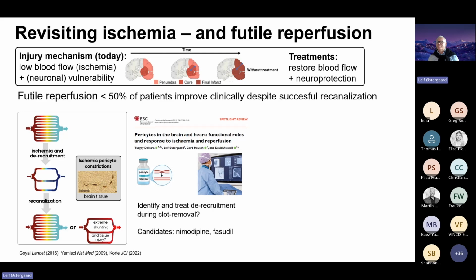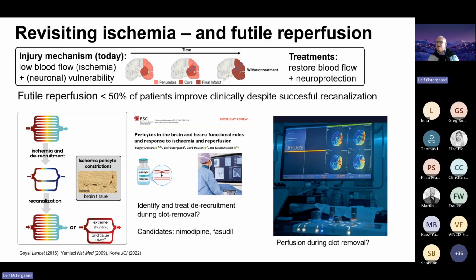In terms of how we can do this while we still have the opportunity to treat, let's say, with additional thrombolytics, if it's little thrombi that keep the capillaries closed, or simply mechanically with saline injections, there is actually software on the way, with modern perfusion imaging, where you can generate maps of CTH as well.